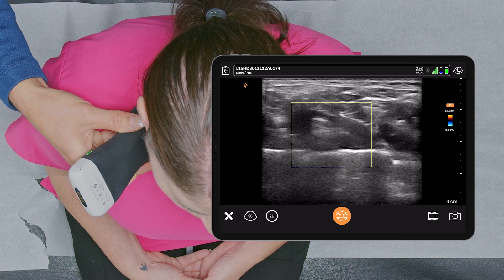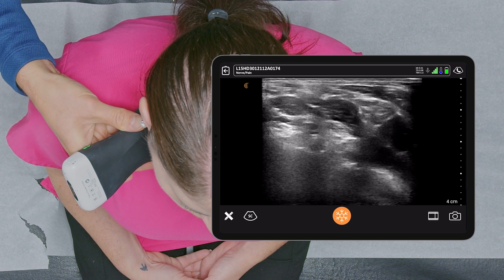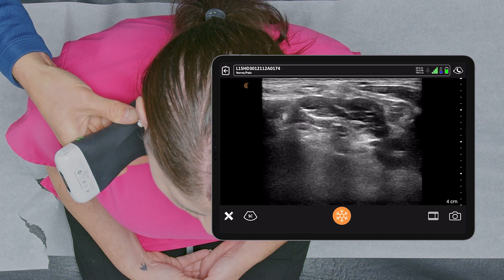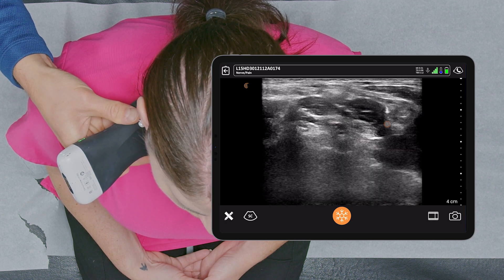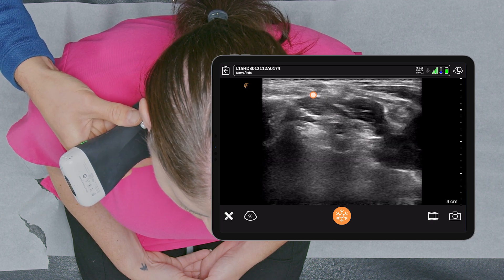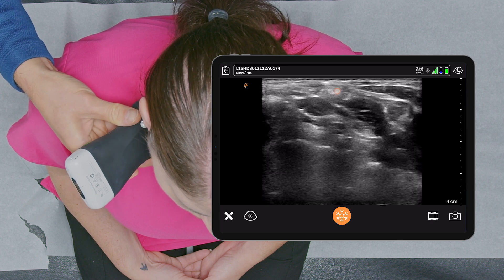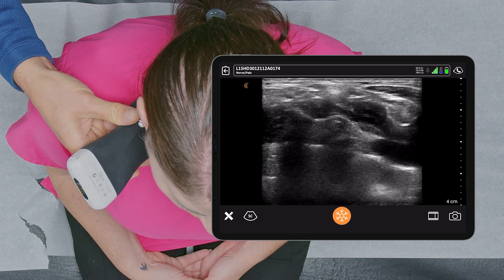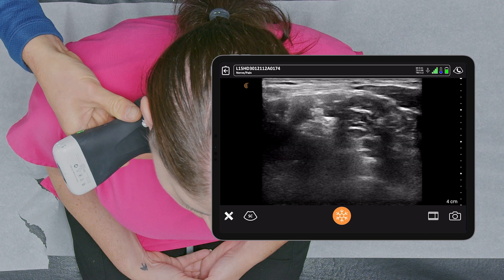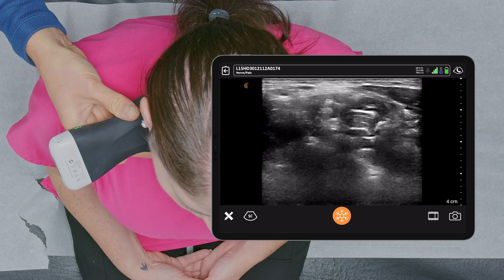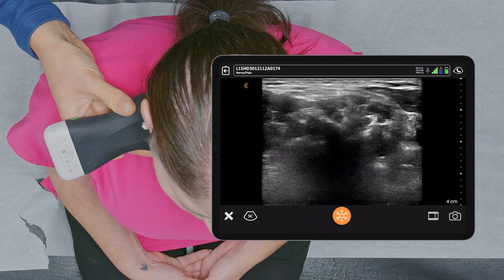I'm going to scan upwards into her neck. In B mode, the scalene muscles come into view. The anterior scalene is on the right and the middle scalene on the left, and the brachial plexus is between them. Following the nerves up to the foramen, you can see them disappear — they're black and hypoechoic.